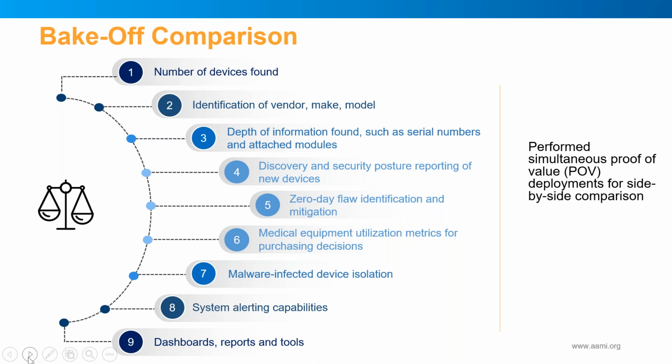One of the big things we were able to see that was very valuable to us was that by being able to identify medical devices by serial number and also by software revision, that enables us to much more effectively manage our FDA recalls. That's something kind of unique to the HTM world and the CE world that IT doesn't have to get involved with very often. Medical device recalls are a very cumbersome process for all of us that have a significant inventory.